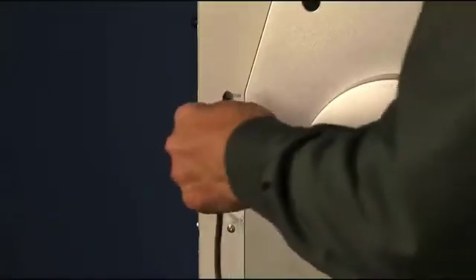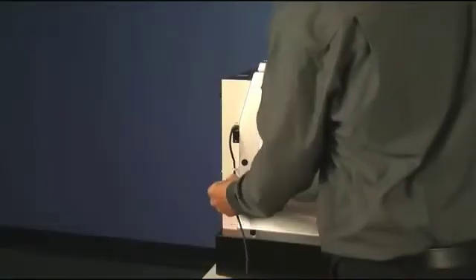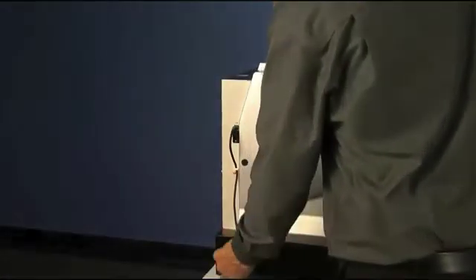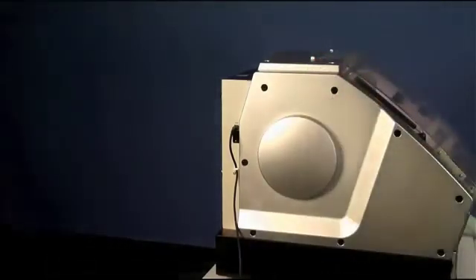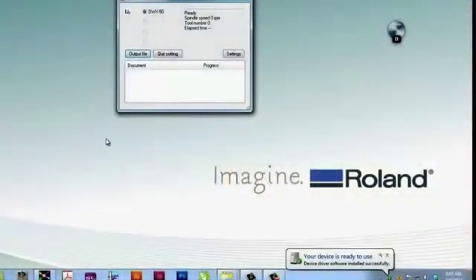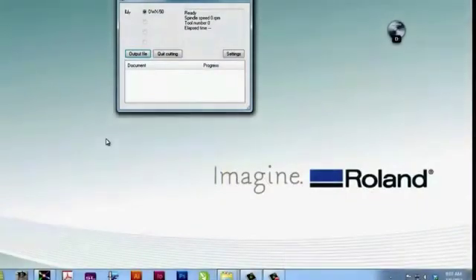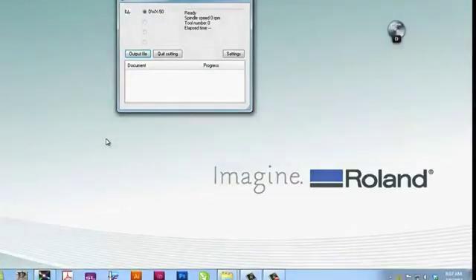You are now ready to connect your USB cable from your computer to the DWX 50. Once you plug in to the left rear USB port of the machine, you can power on your DWX 50 at the main switch. At this point, you will notice your device driver being installed successfully and the DWX 50 will show up as a ready status in your virtual panel.